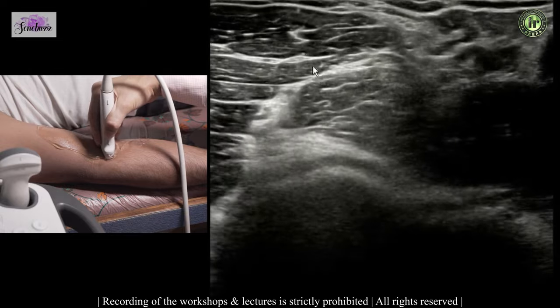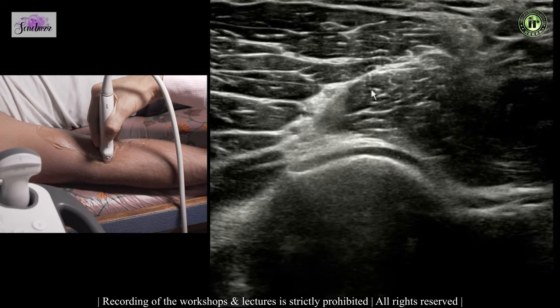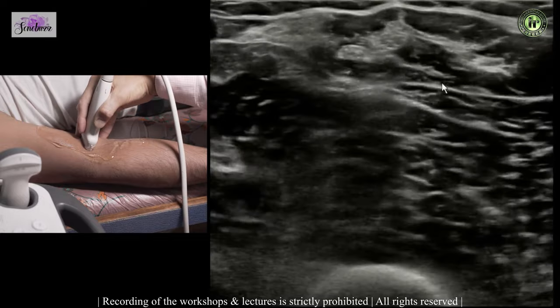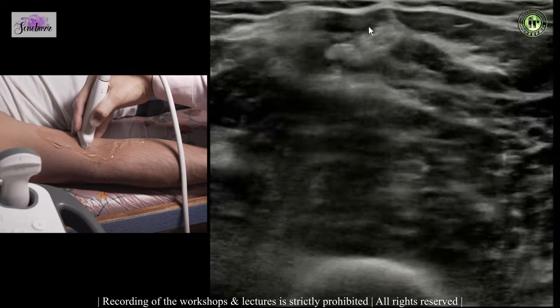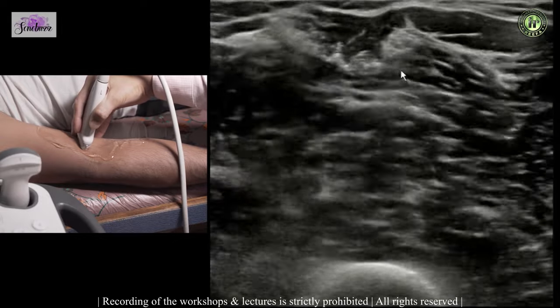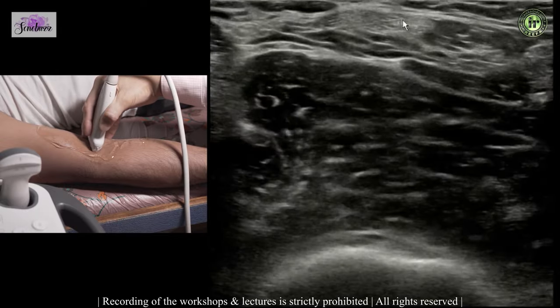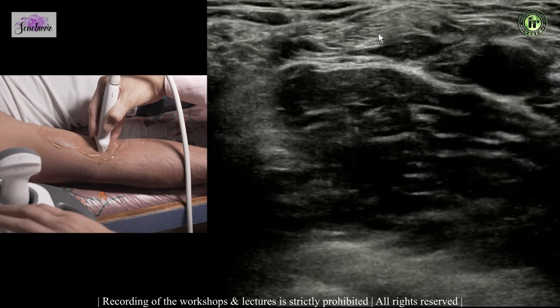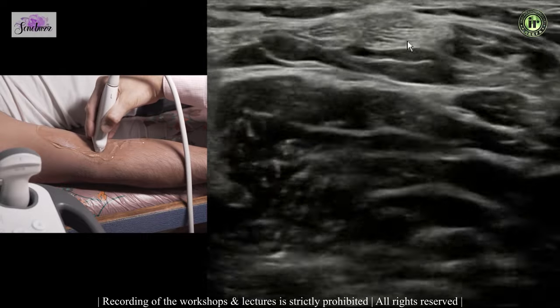Going laterally you will see the brachioradialis and brachialis with the radial nerve in between. We then scan the distal biceps tendon, which is a tricky structure. That is the distal biceps muscle belly with the echogenic tendon forming within its centre, and that is your brachialis. As you come down, the tendon is forming there; decrease the depth and take the focal spot up so you can see the tendon fibrillar echo pattern in the transverse plane.